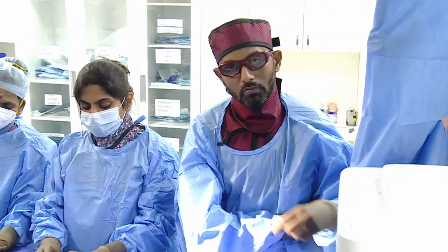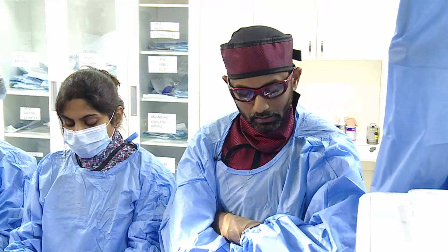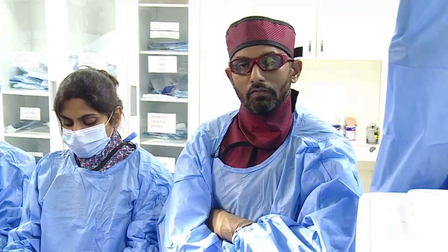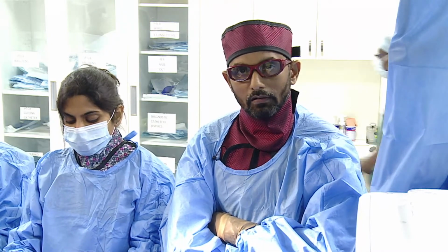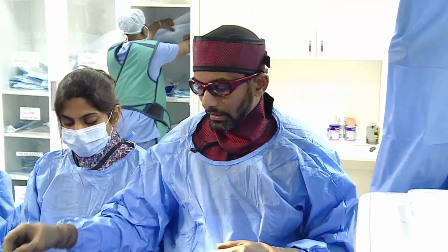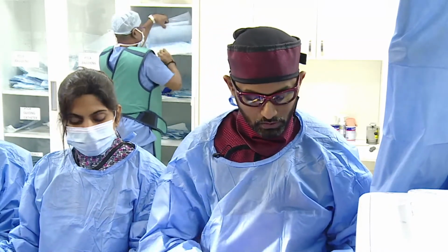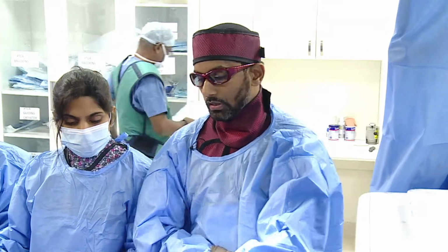So this is something which we've been routinely using for higher caliber diameter catheters for angioplasties. And I think most of our PCIs, particularly if it's a CHIP PCI, we are going with the 7 French slender sheath through the right transradial approach. So the advantage, as you know, is that the transradial approach is much easier for the patient and the recovery rate is also very quick. So with that, the idea is to get an XB3 guiding catheter, 7 French, into the LAD, and we'll take some pictures to see what is the current situation now.